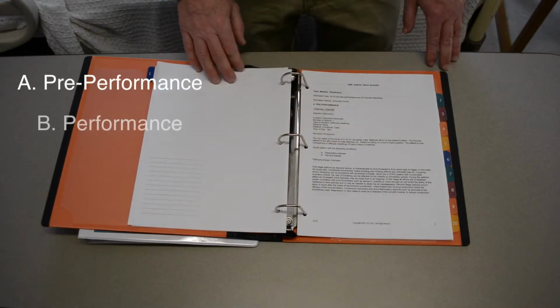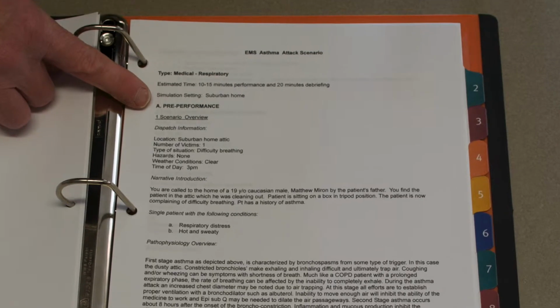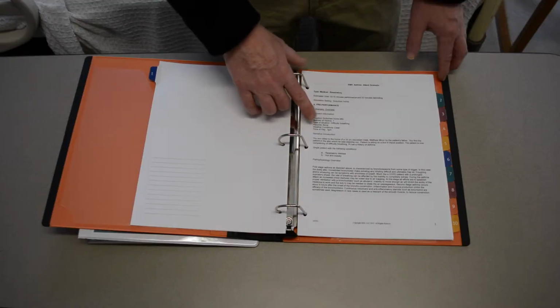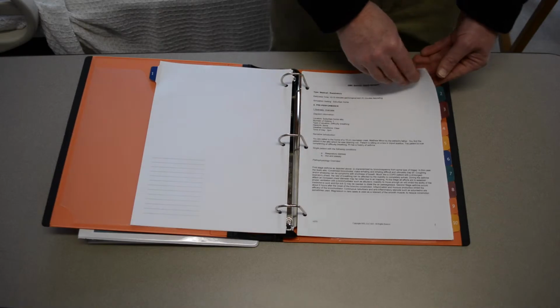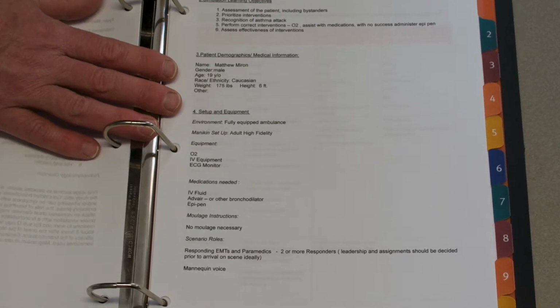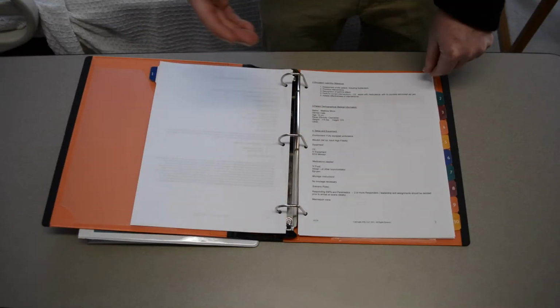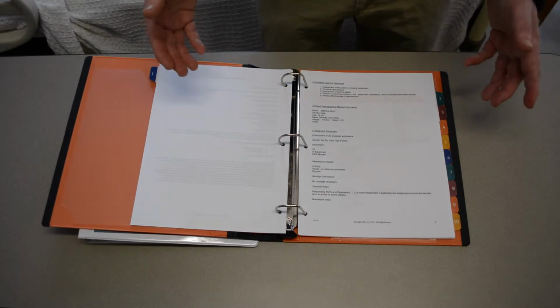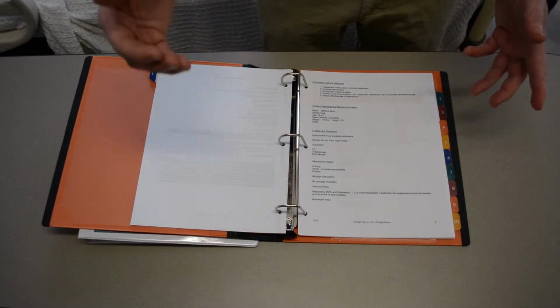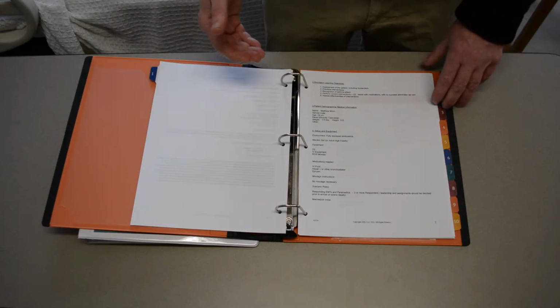Within each scenario, there's a three-part organization system. We have the pre-performance information, which includes an overview of the scenario objectives, as well as equipment needed, the patient demographics, and pathophysiology information. This will allow you to quickly and efficiently assemble all the equipment that's needed, as well as provide the pre-scenario information to the students to get started.